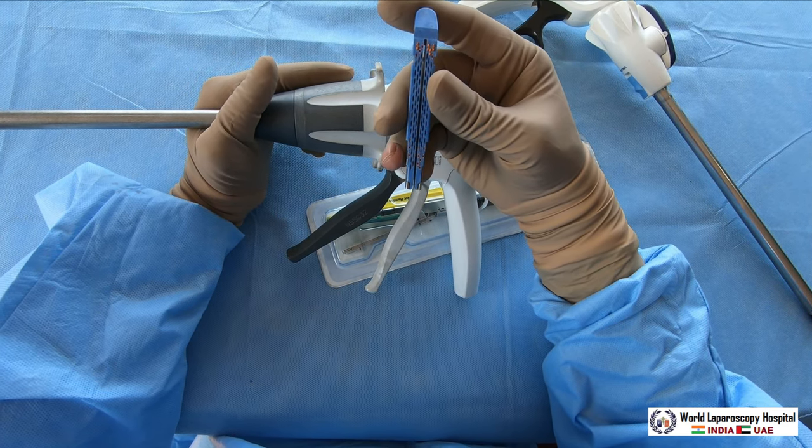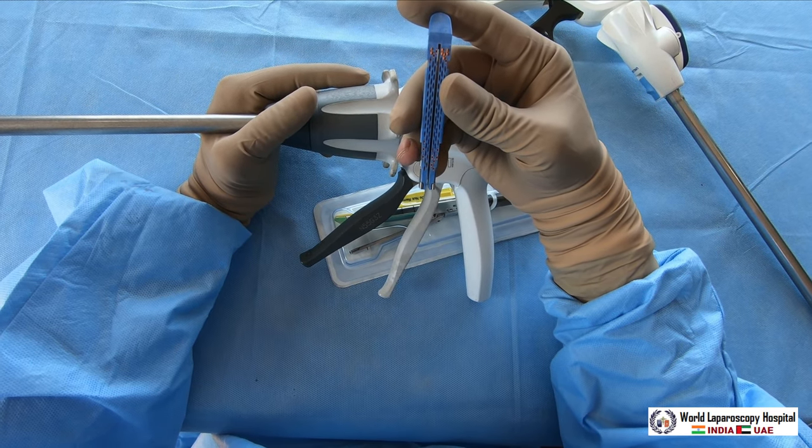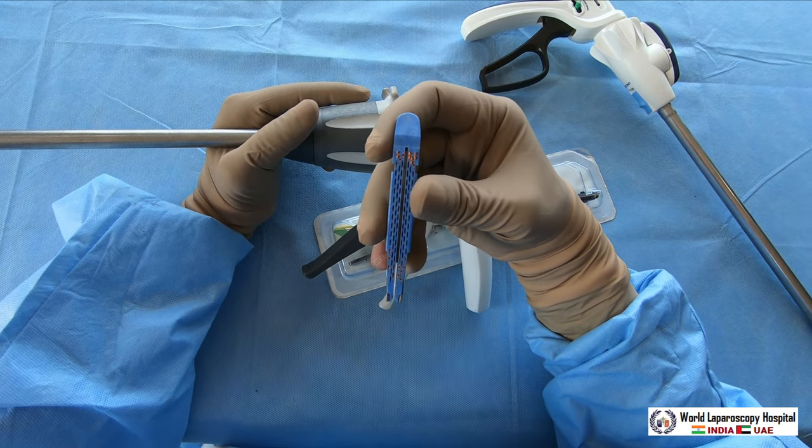The colors available are blue, green, and white. Blue color cartridge is generally used wherever you want to do bowel resection.